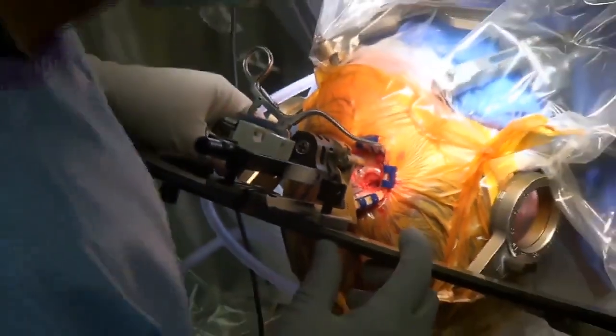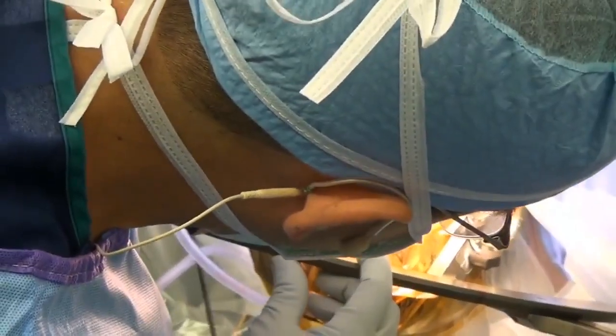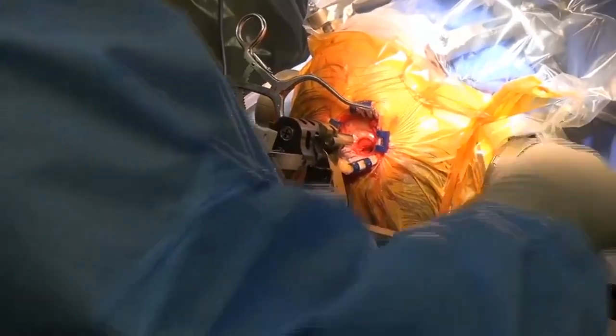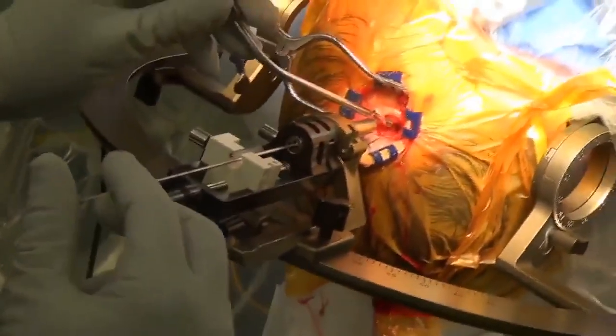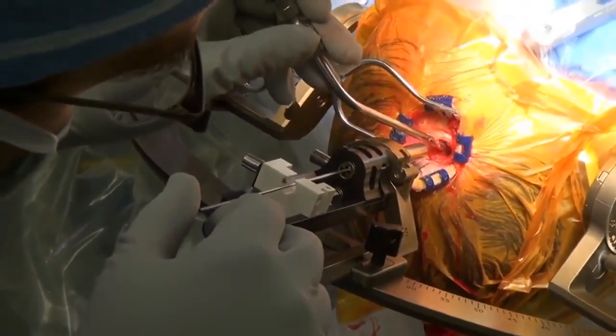All right, we're back to 68 on our ring. That's good. Okay. All right, so we start now. We basically want to accomplish this by disrupting the brain as little as possible.